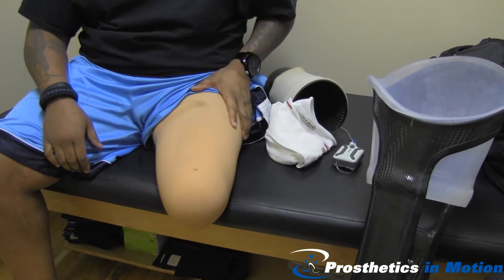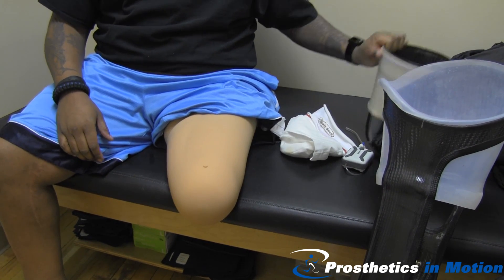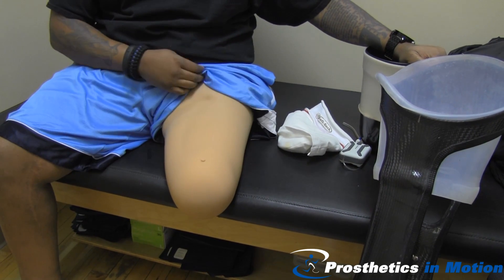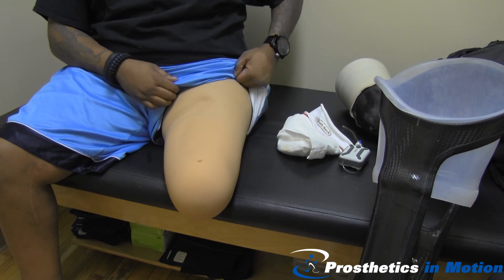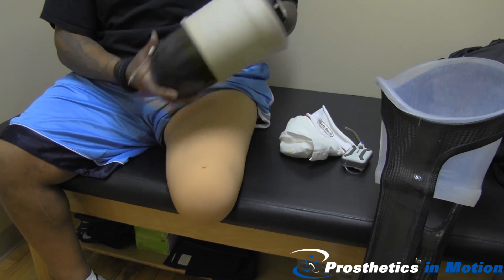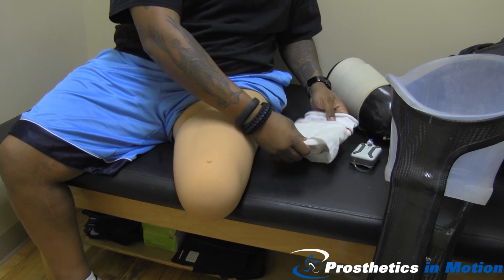Today we're going to demonstrate how Pete puts on his knee disarticulation double wall vacuum prosthesis. The liner on his residual limb is custom made of silicone. A double wall system consists of an end cap that's laminated and a seal. First he's going to put on some socks.